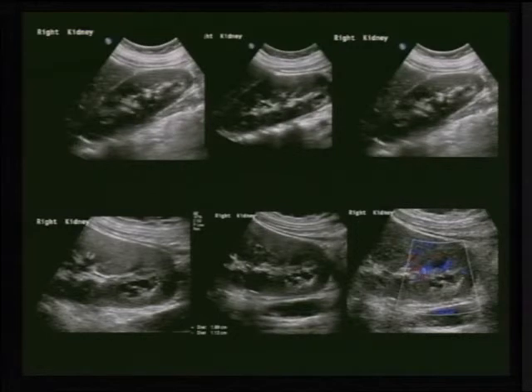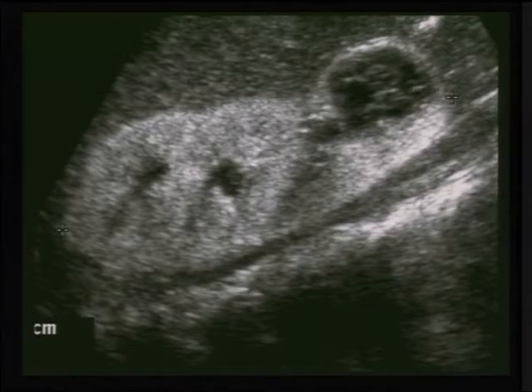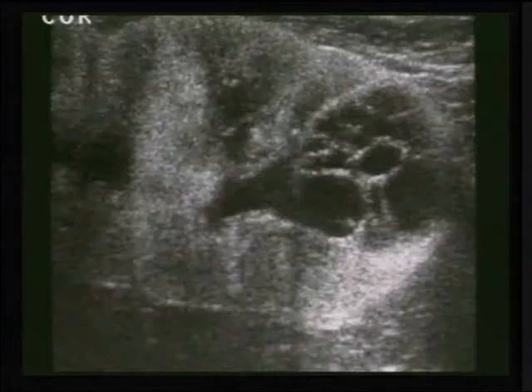If we see a cyst similar to that, which has thick septation, irregular, I should not be happy to call it calyceal diverticulum. This could be a malignant lesion. And if you see a septated cyst like that, also you should be worried that it could be a malignant lesion.